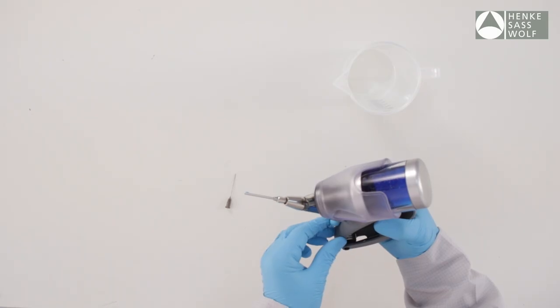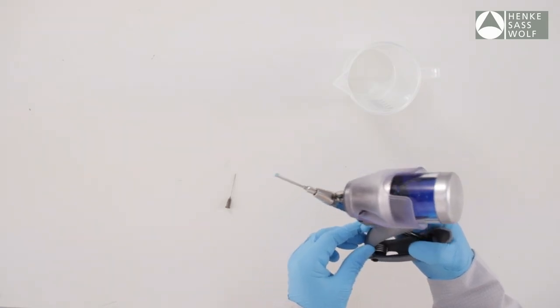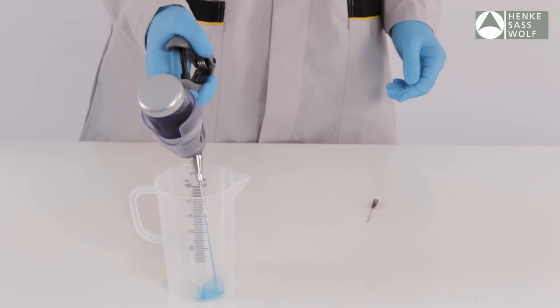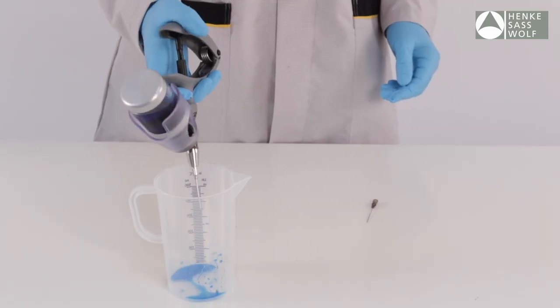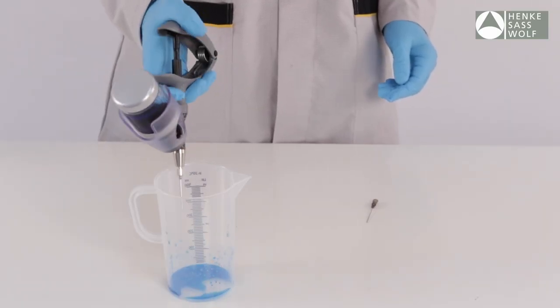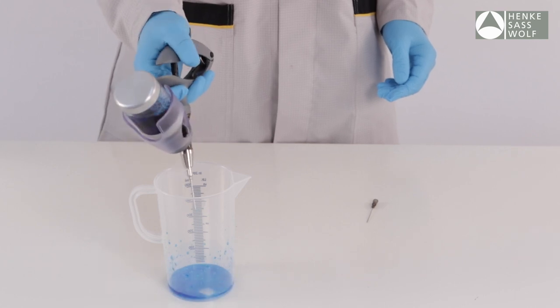Squeeze handle and then release quickly to draw fluid into the barrel. For adjustable syringes, it is recommended to prime the syringe on the maximum dose and dial down, especially for low doses.